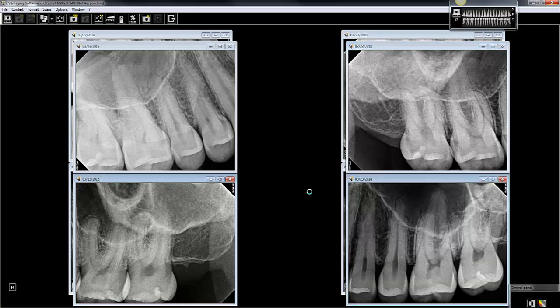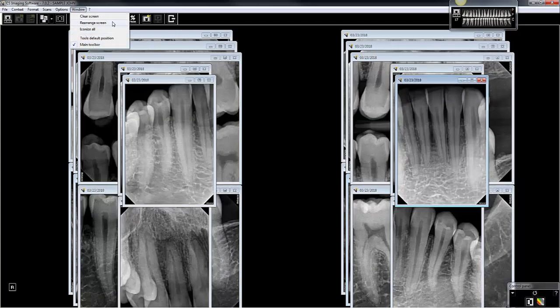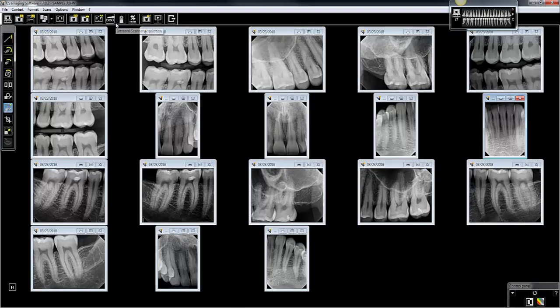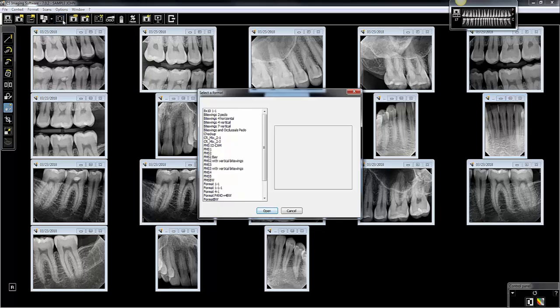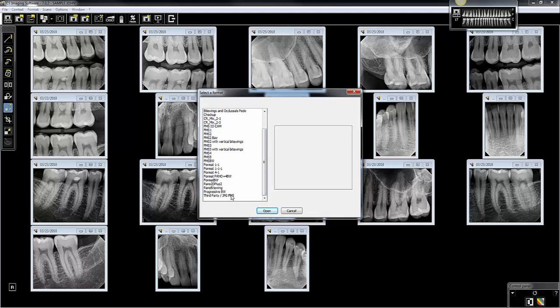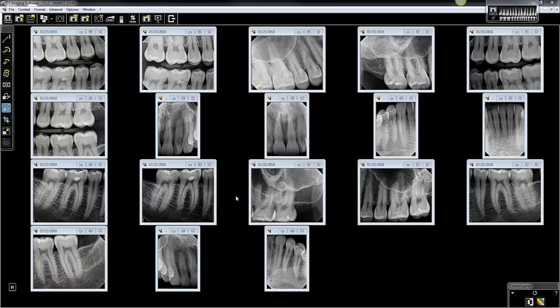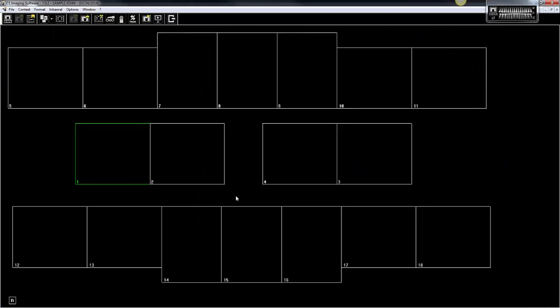Once it's finished importing all the images, come up here to the Window menu and choose Rearrange Screen. You'll notice that it shifted them all around so they're not overlapping at all. Next, come up to your user format icon, and when you scroll all the way to the bottom, you'll notice a Third-Party JPEG FMS. Double-click on that.